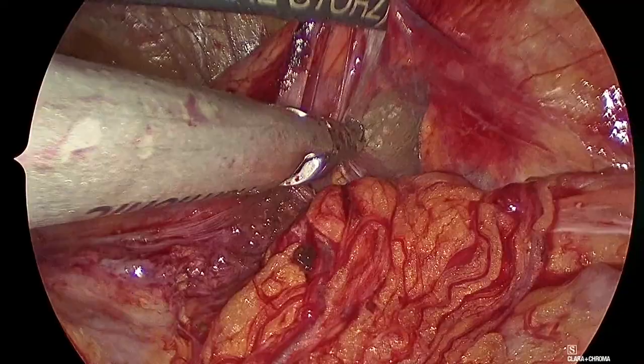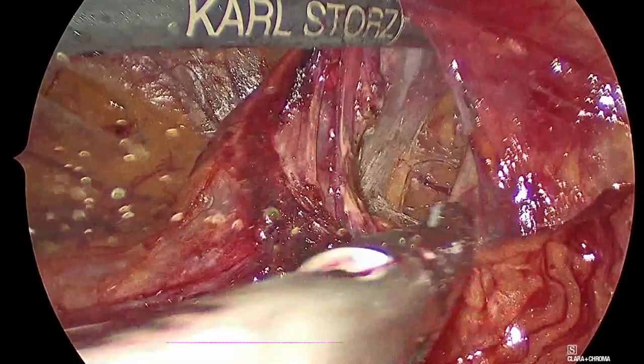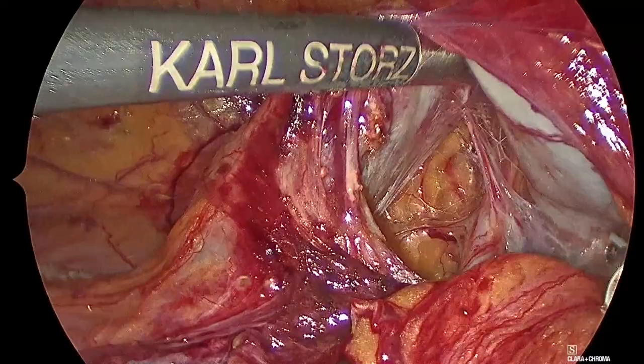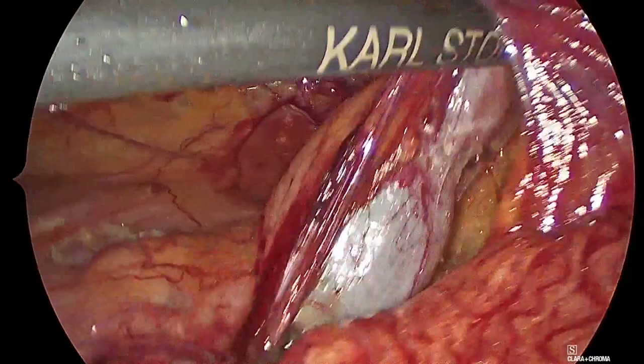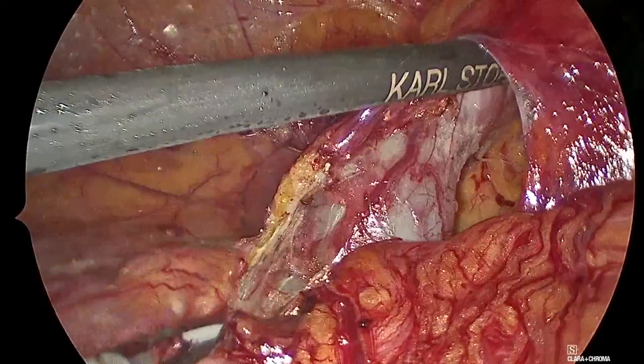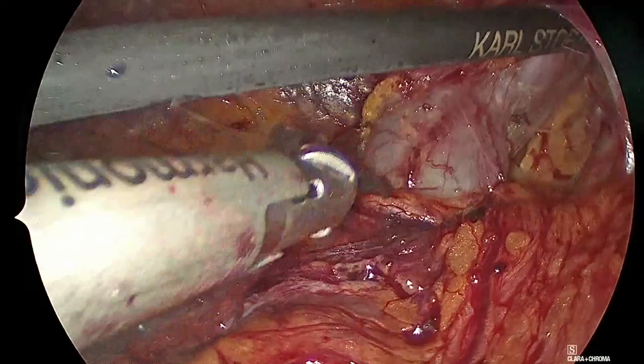Alberto, you ever use a monopolar instrument on your right hand, a scissor or something? Look, there's an artery here, you see? You see the artery? Here. Beautiful, yes. Okay. If I use what? I'm sorry, Marcus? A monopolar instrument in your right hand, do you ever use it, a scissor or a hook? Rarely. I don't like monopolar energy. Okay.